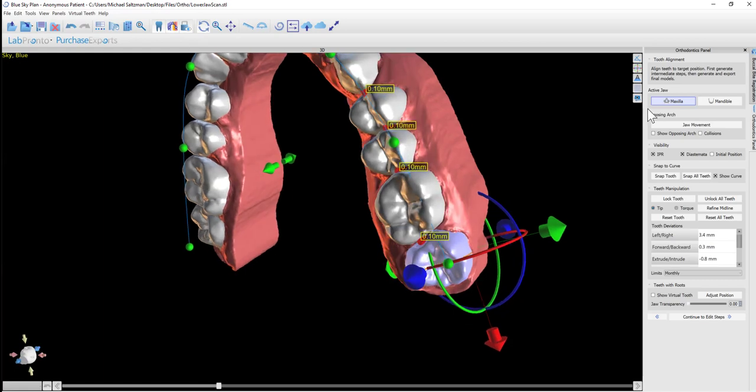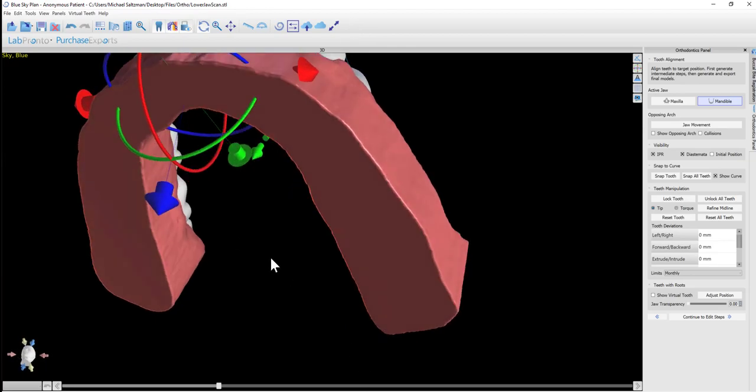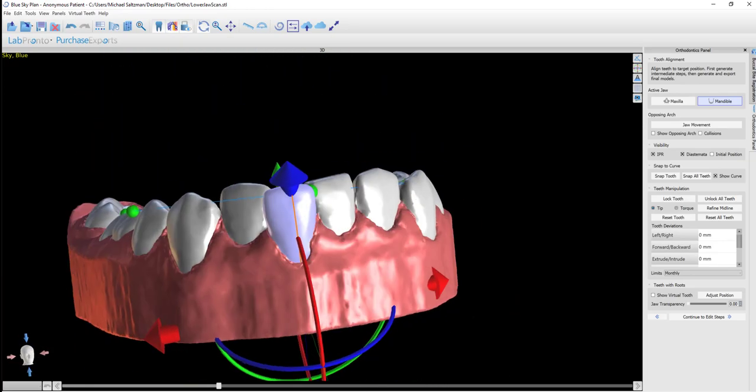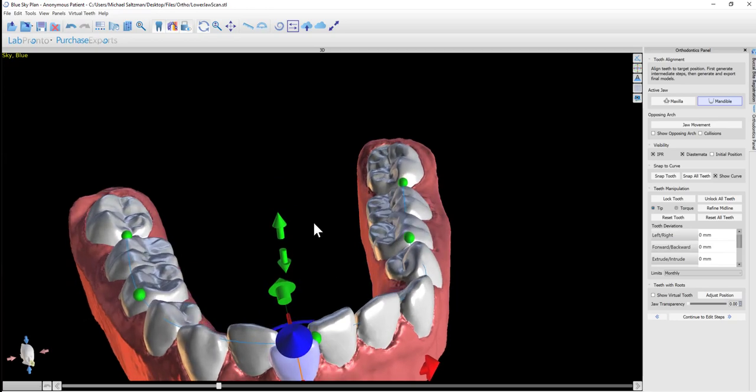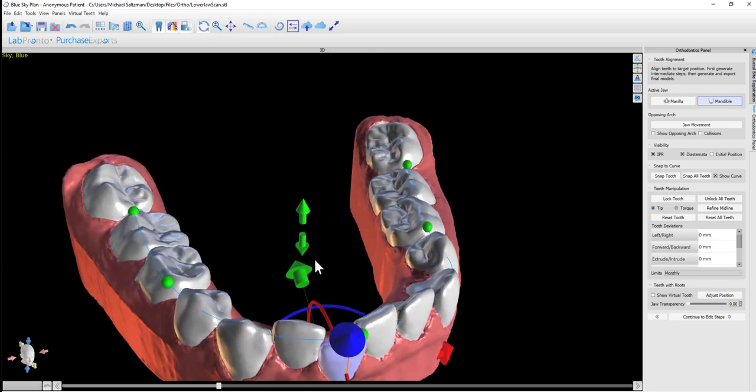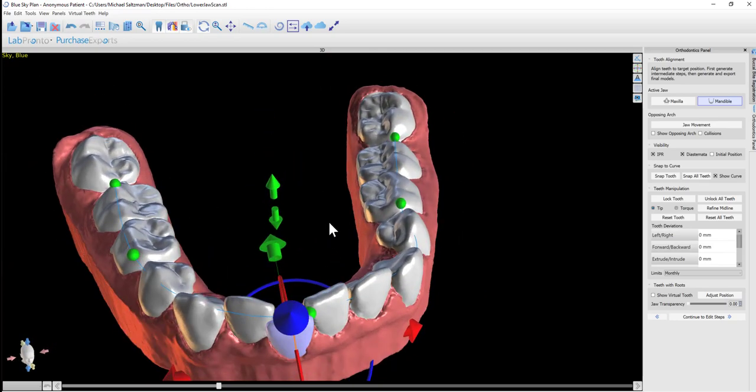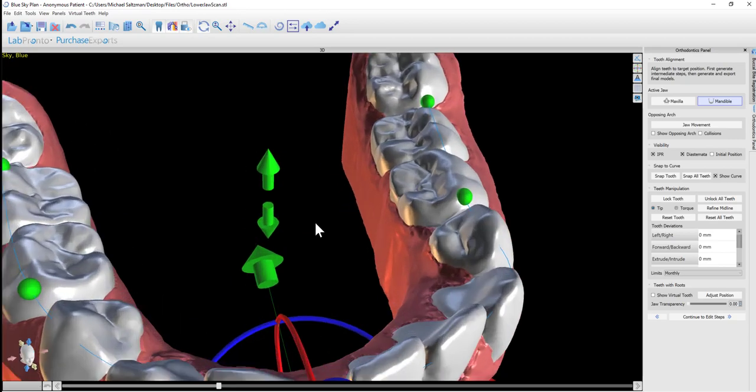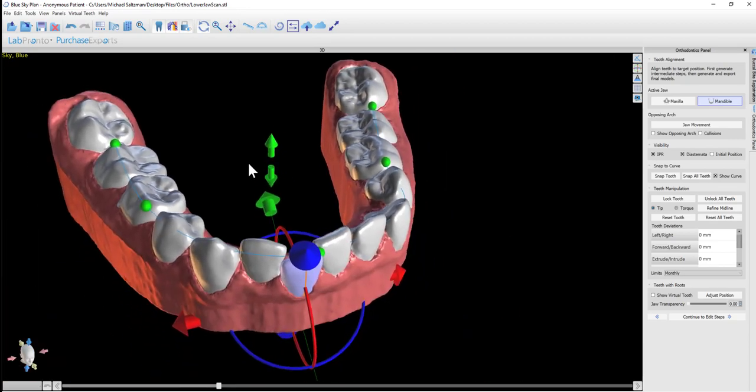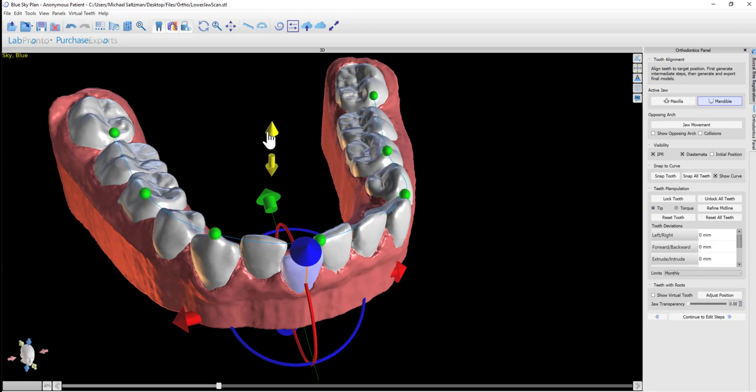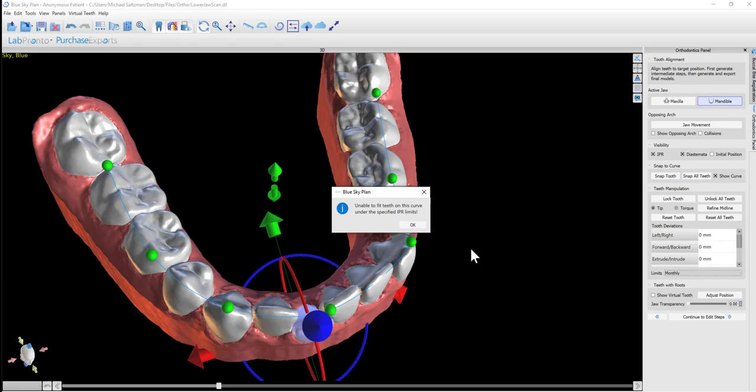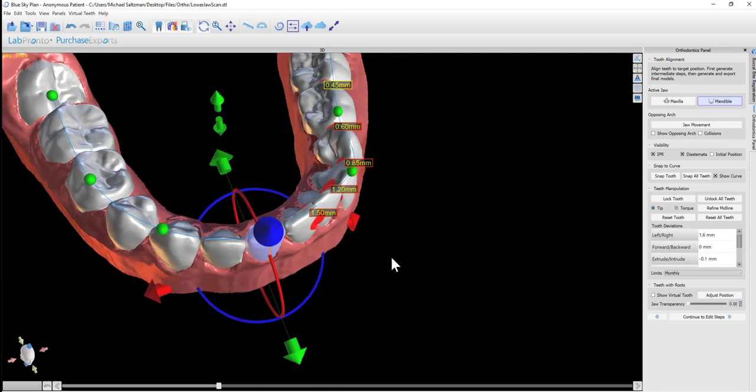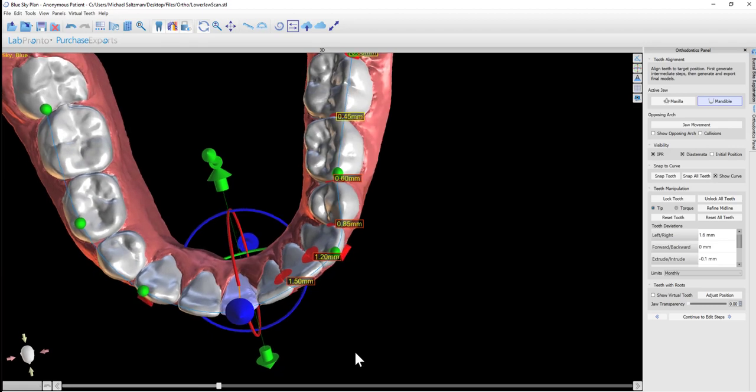We just did that for the maxilla. If we want to snap the mandible to the curve, we click on mandible. I'm using the left mouse button to rotate here. Our normal mouse controls are active. The wheel of the mouse moves the model around, the left mouse button allows to rotate, and the right zooms in and out. Here we have our curve and I can click snap all teeth. We got a message: unable to fit teeth on this curve under the specified IPR limits.